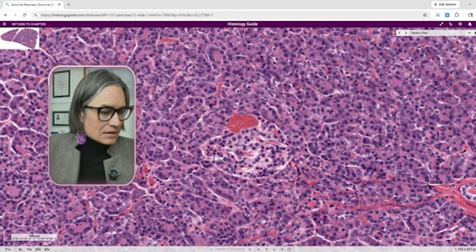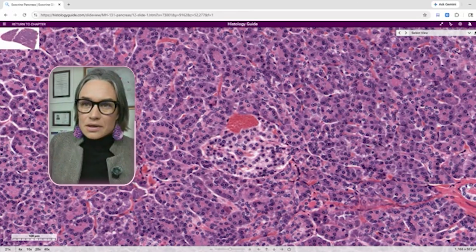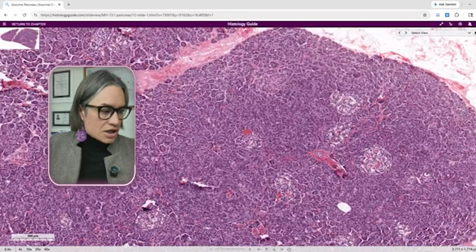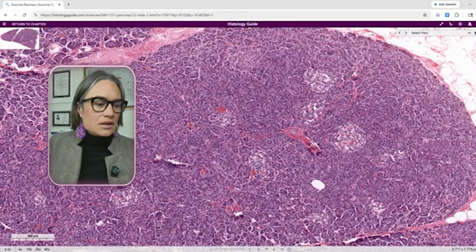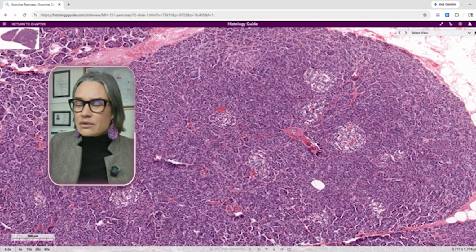And you can see that they are lighter. From far away, you can see that they are like clumps in the sea of these other acini. So as we said, most of the tissue is exocrine, giving support for digestion. And then we have these islets that produce insulin and glucagon, the hormones responsible for regulating the levels of sugar in the blood.